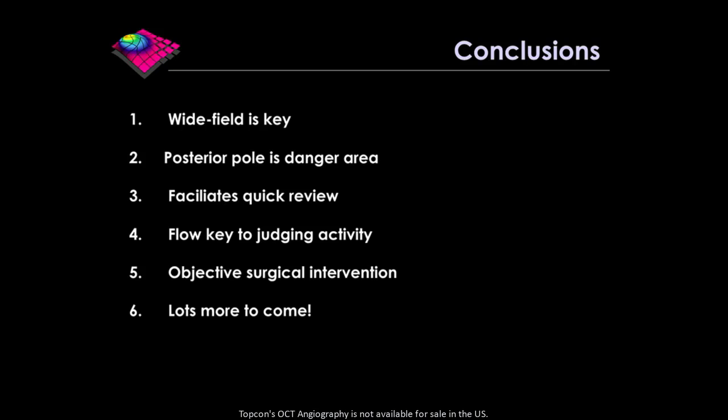As I've said earlier, the software is getting better all the time. The analysis tools are getting better all the time. And I'm more of a macular degeneration person than a diabetic retinopathy person, to tell you the truth. But in the last couple of years, that's flipped. And now what I'm interested in is the diagnostic imaging in these cases.